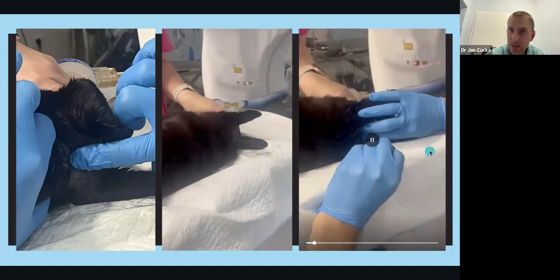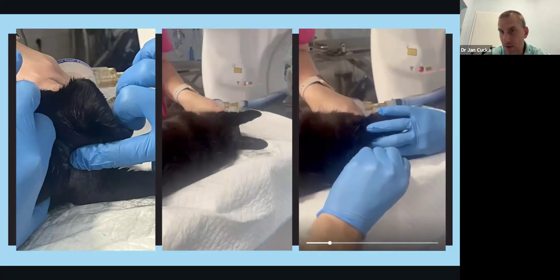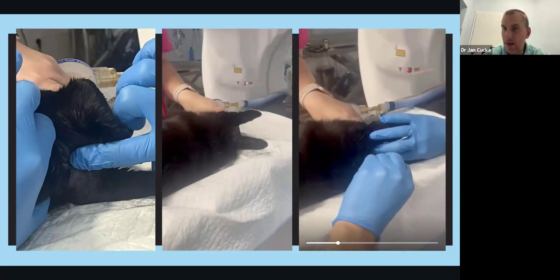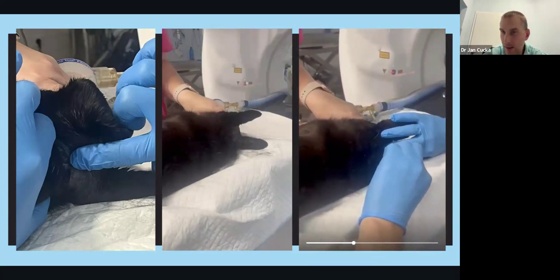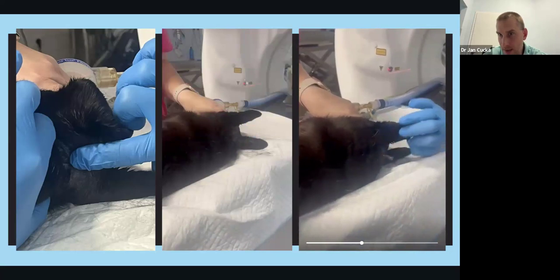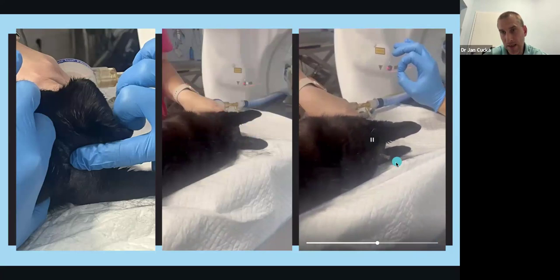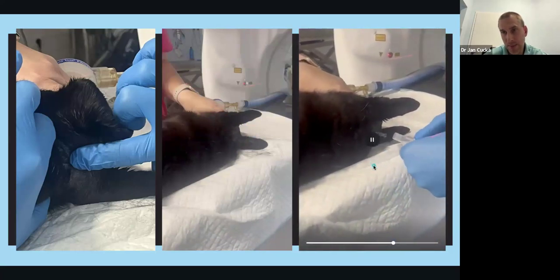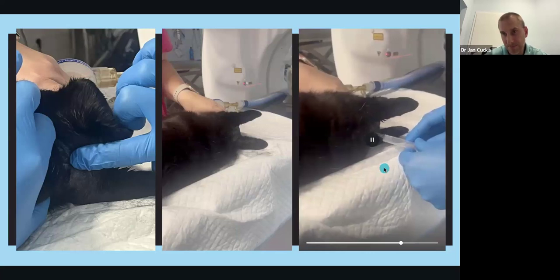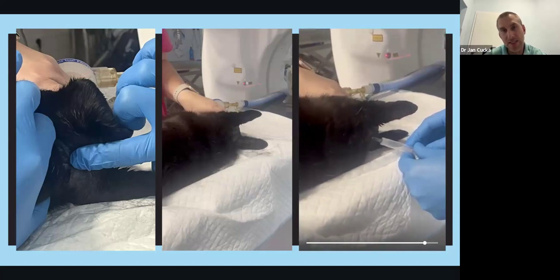there is application. I'm a left-hander, so I'm sorry that in the video you couldn't see the needle perfectly at the beginning, but now you can see the liquor is coming out, and I'm in the right spot. So this is CSF collection.